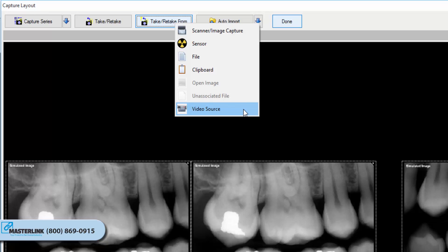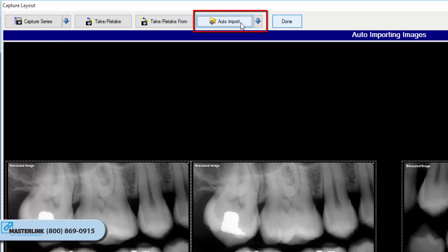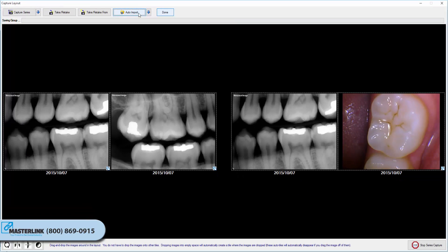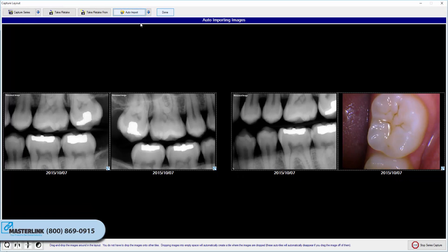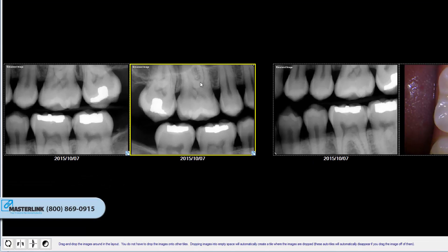And Video Source: the software will prepare capture from the direct video extension and any attached intraoral camera. The Auto Import button automatically imports images from a Windows folder location and places them into the layout tiles. Warning: if the Auto Import button is used within the layout capture screen, the images will automatically be deleted from their original file location.